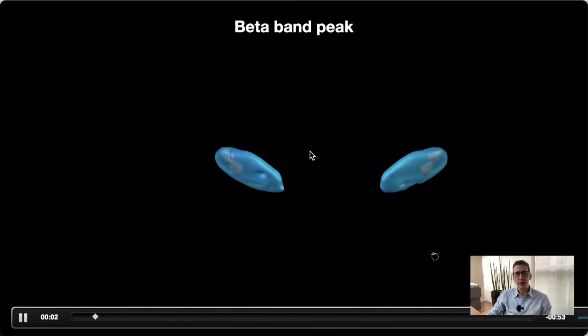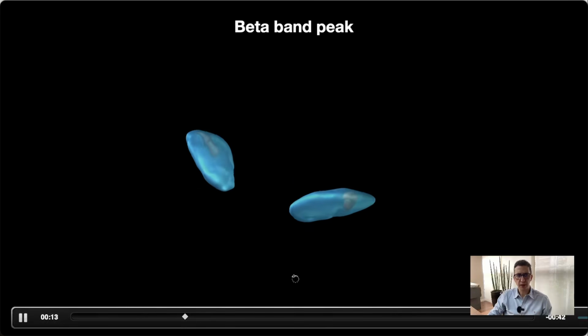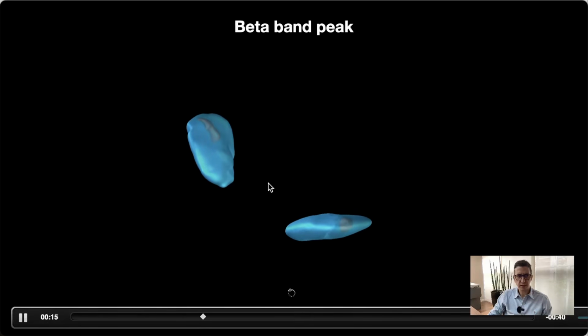When you look at the beta band, we know that when you decrease the activity of the beta, you are going to improve the motor symptoms, especially the bradykinesia and the rigidity. And this is from DBS. I'm going to stop the video just to show you.